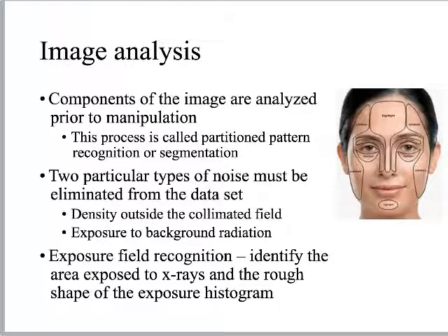Something to consider. One way to think about the barium, if we're going to continue with the makeup analogy, is like, so I want Morphe Model A. That's what I'm shooting for with this data, right? I want to make the transformations that make this person look like this. But let's say they have a tattoo of a tear on their left eye, right? That changes things considerably, right? If there's a tattoo or something going on with this person's face, that would be like the barium. They wanted it there. It's not an artifact in their opinion. That's the way they wanted the tattoo, and they got it on their face, right? But it does kind of change the way I'm thinking about doing their makeup, right?